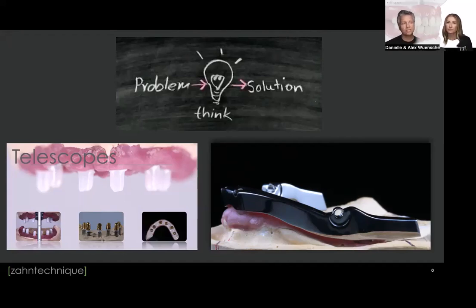And some patients prefer that. Some doctors prefer that as well because they don't trust the situation. Oh, something is just like an adhesion fit on the telescopes and they don't trust it. I'm chewing a chewing gum and it pulled it out, right, or candy. So they don't trust the process or they don't trust the situation. So with an MK1 with an attachment bar, they're really well served because it's rock solid in the mouth. Nothing is moving, especially at night, right?